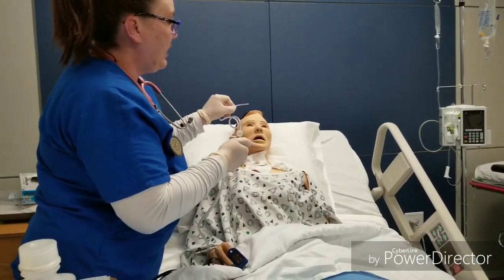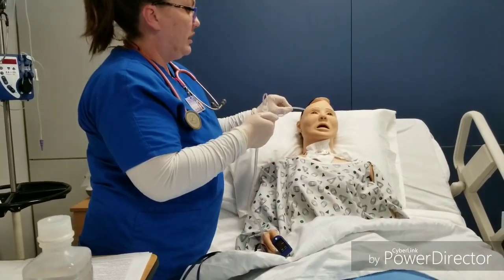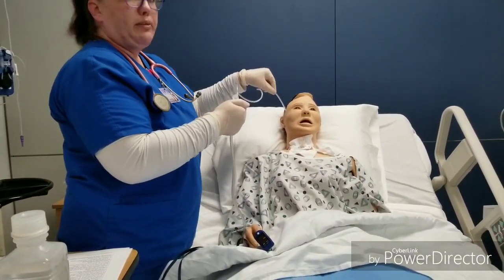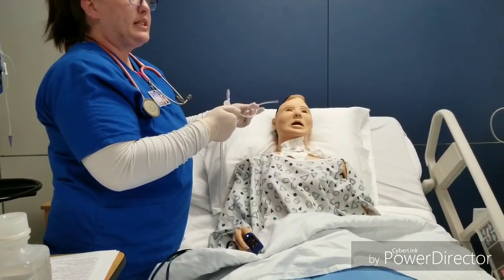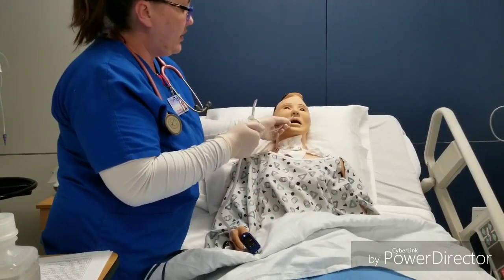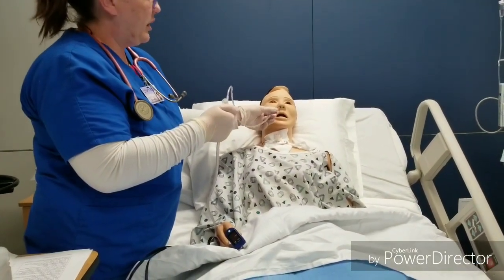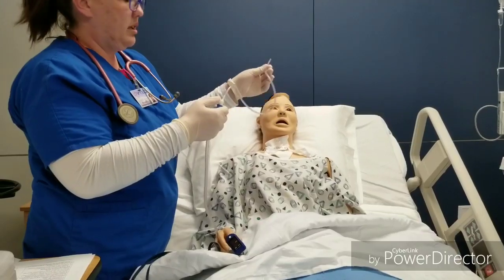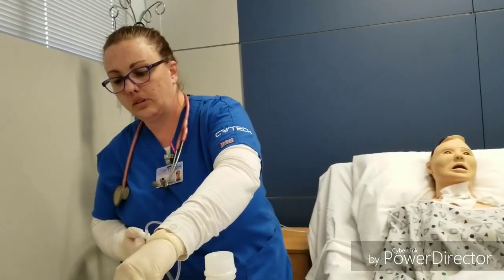And you're going to go in, and as you come out, you're going to do the pill roll, and that helps you kind of get everything. And as you're going down, you'll go down until your patient starts to cough and pull out, and you don't want to go any longer than 10 seconds. So in, and I obviously cannot go as far in as what you would normally go. Go in, suction, suction, suction as you're pulling out. And then I'm going to clear my tubing.